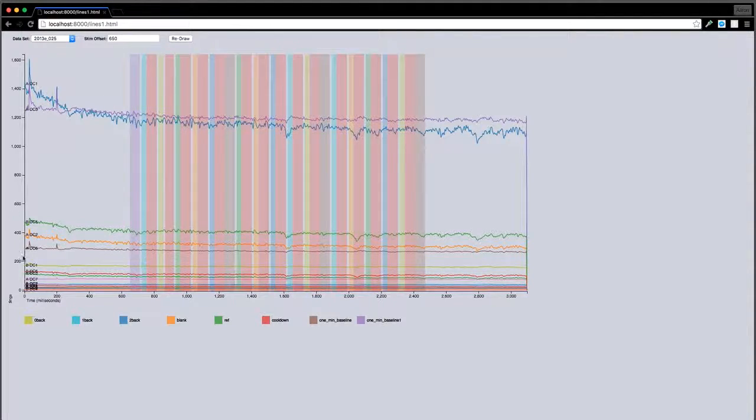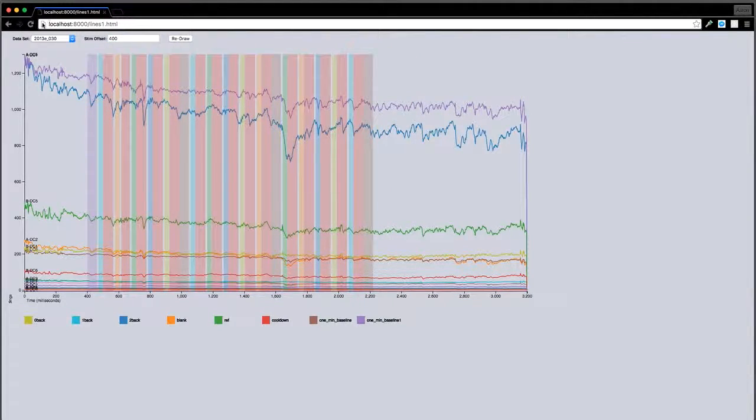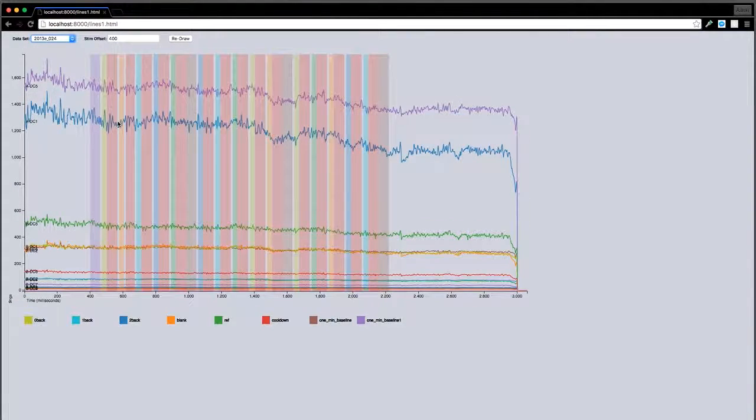So that's definitely the basics of how the interface works. Up here, you can select a different data set, which will reload it, and you can see definitely different brain activity here. And then you could change the offset again if you'd like, and then move to a different data set. But that's the basics of how it works. The goal here is to just provide a quick visual representation of the data.